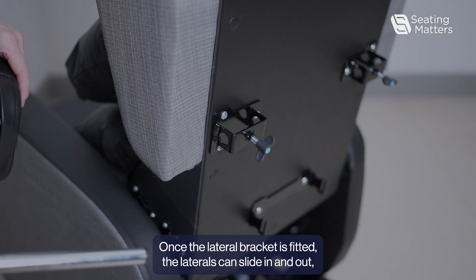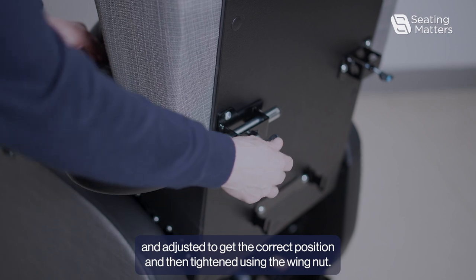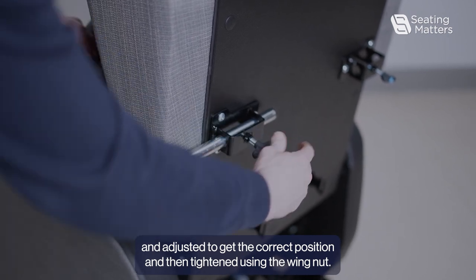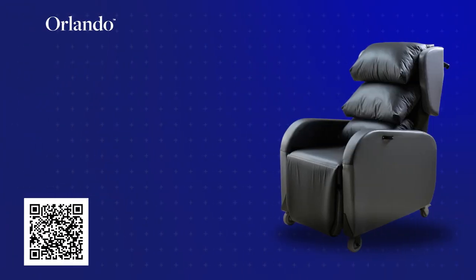Once the lateral bracket is fitted, the laterals can slide in and out to adjust to the correct position, and then tighten it using the wing nut. Thank you.